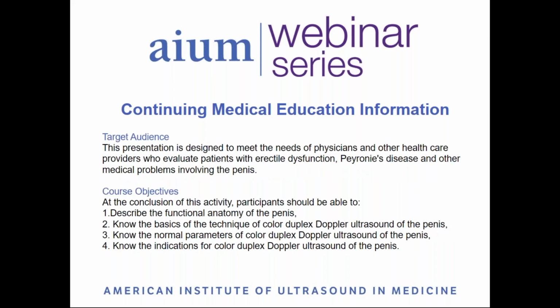By the conclusion of this webinar, participants should be able to describe the functional anatomy of the penis, know the basics of the technique of color duplex Doppler ultrasound of the penis, know the normal parameters of color duplex Doppler ultrasound of the penis, and know the indications for color duplex Doppler ultrasound of the penis.